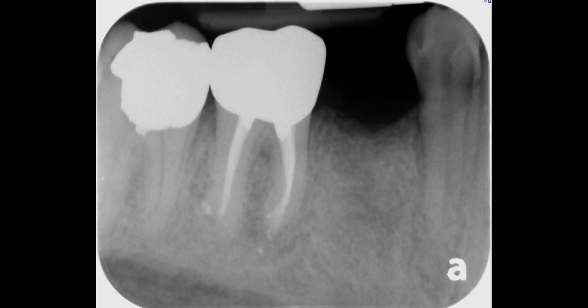This periapical radiograph was taken to evaluate the site of missing tooth number 29. Number 30 is endodontically treated with a periapical radiolucency, and this tooth was eventually extracted. If you're planning an implant at site number 29 and also number 30, what are some vital pieces of information that you must have prior to placing an implant?